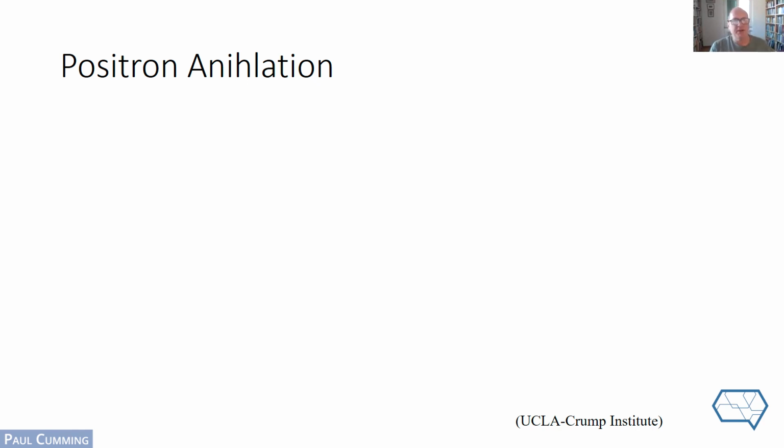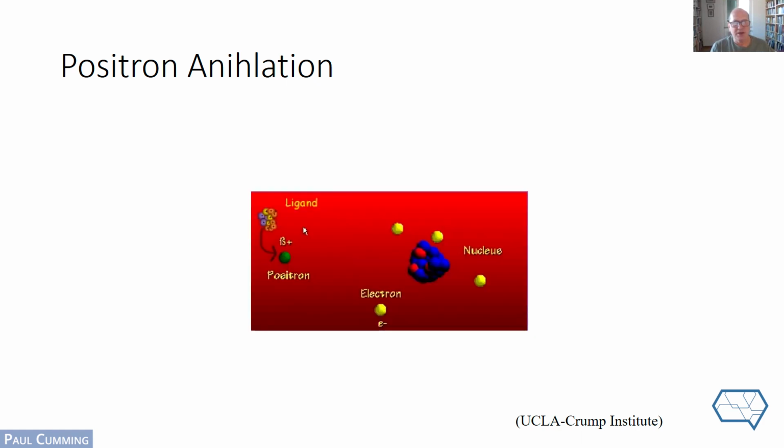So here, if you click again, you'll see the principle of positron annihilation. Advance the slide. So there you see a proton, and rather a nucleus on the right-hand side occurring in the medium of the brain, and a ligand, that is the molecule that contains, let's say, fluorine-18, and decays with a half-life of 2 hours, randomly releasing an antimatter electron known as a positron, beta plus, which floats around in the medium of the brain, or rather it travels with some high energy.